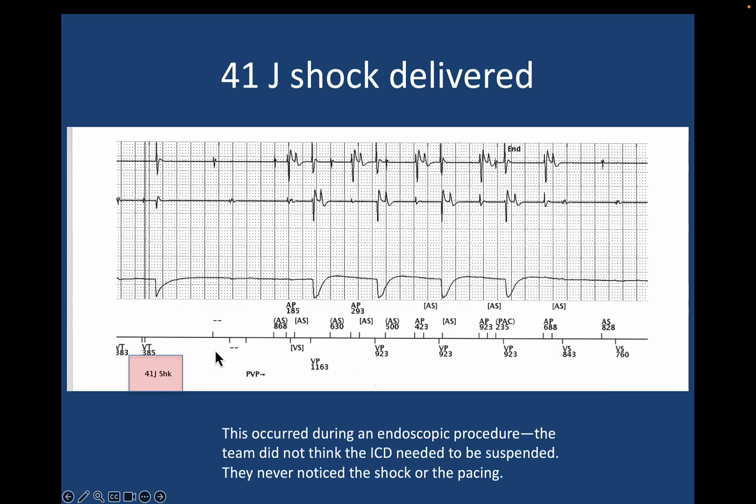Now, this occurred during an endoscopic procedure where the team didn't think that the ICD needed to be suspended. They never noticed the shock, and they never noticed the ATP.